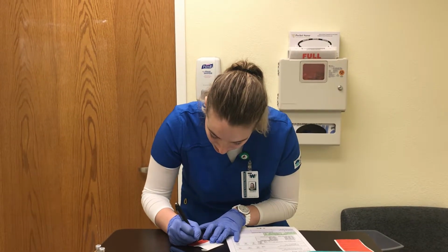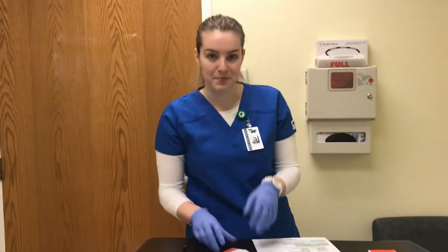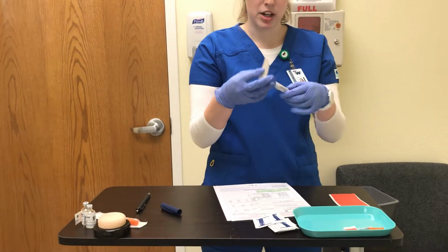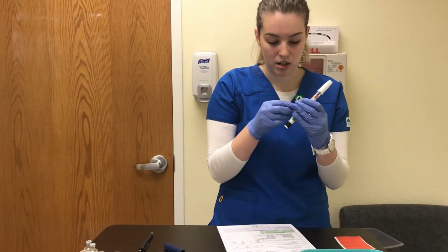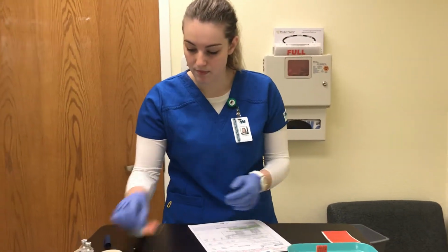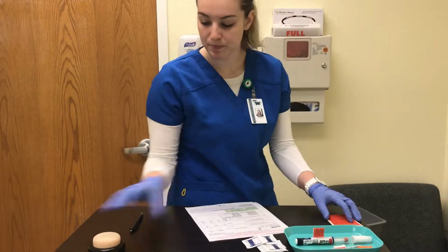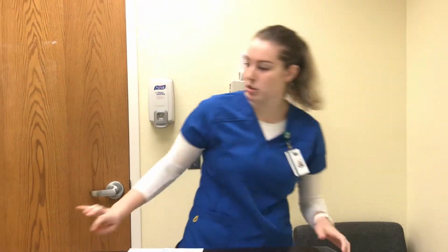It is October 9th of 19, and it is 17:15. Okay, and I'm just going to put this on my pen, but I don't want to cover up any of my patient's information. So I'm just going to loosely put it on here. Kind of like that. Okay, so now I have all of my stuff ready. So I'm just going to clean up my workspace so I can go into my patient's room. And I'm going to deglove. As I leave my med room, make sure my workspace is tidy, and move over to my patient.